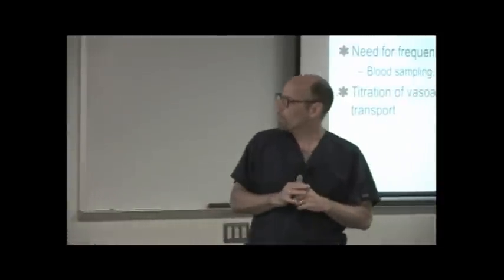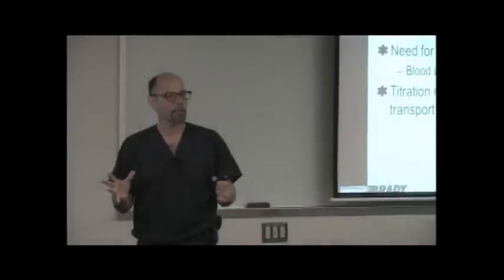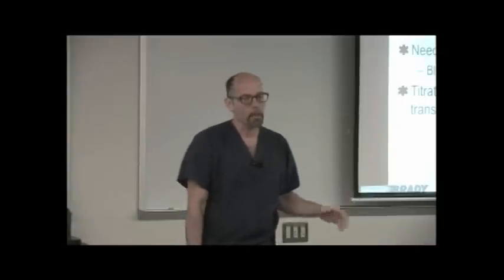Good. Despite what you might be told by somebody in your career, the patient has to be supine, so they have to be on their back, they can't be side-lying, but they can have their head of the bed up as high as 40 degrees. So they can have the cot up at 40 degrees. As long as they're on their back, I can level and zero at the phlebostatic axis. Any higher than that, sitting up or side-lying, that's not acceptable.